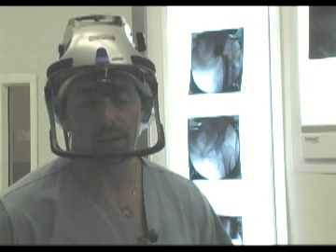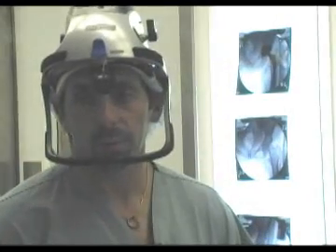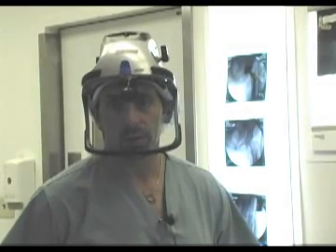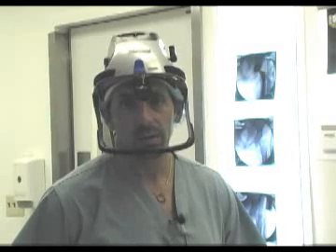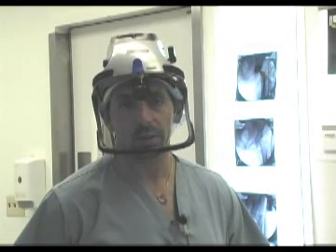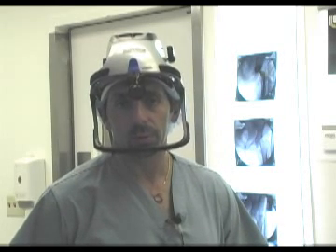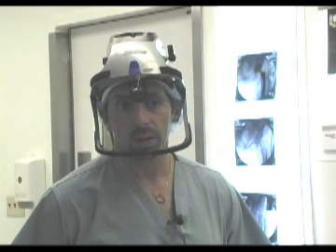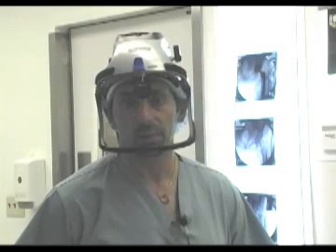Based upon her young age and activity interests, I would suggest a hard bearing surface. We're going to choose a metal-on-metal bearing surface based upon its benefits and try to do her procedure for rapid recovery through a direct anterior approach using the OSI HANA table. For this approach, I tend to use stems that are broach-only designs, and so for her we'll choose the DePuy Corail stem with a Pinnacle metal-on-metal bearing, which is probably the best stem to use for this particular approach based upon the ease of access to the femoral canal.